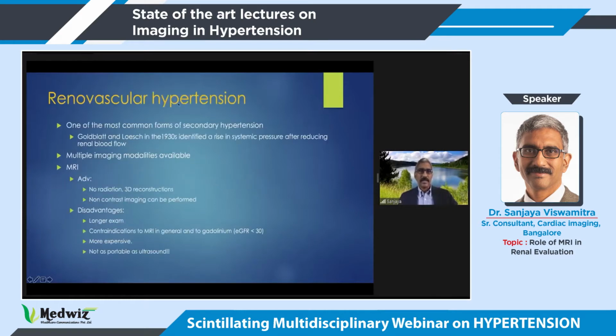So let's look at renovascular hypertension. We've discussed this in great detail in this session. It's obviously 1 to 5% of all the patients with hypertension will have renovascular hypertension. And our aim, therefore, is to use modalities which can evaluate it.